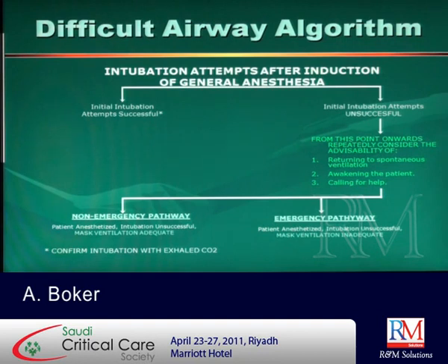Cannot intubate, can't ventilate, you do not go again and do the same step. So we've talked about options. Now you need to intubate different ways. And now we're talking about the different ways. What are these different ways? So we said we could intubate through LMA, fiber optic intubation, fast track.